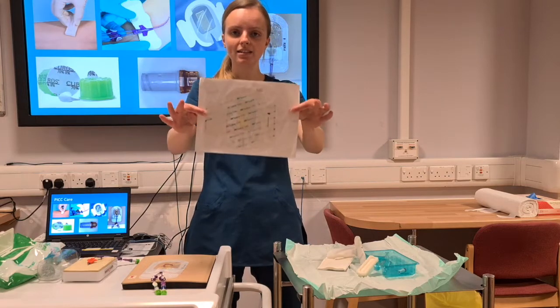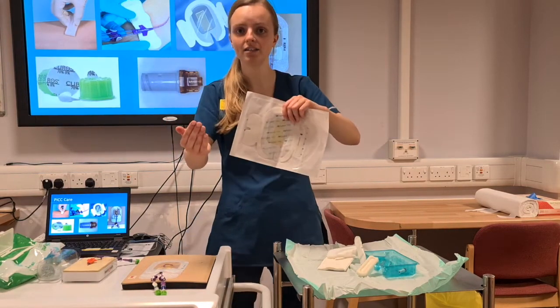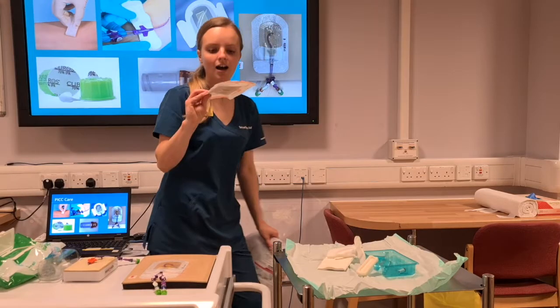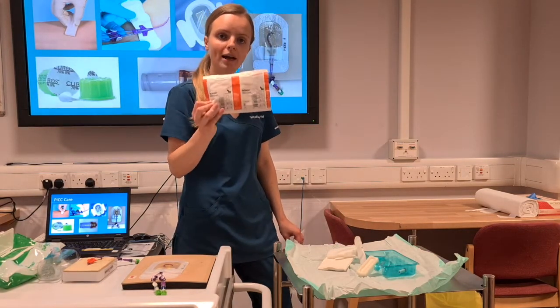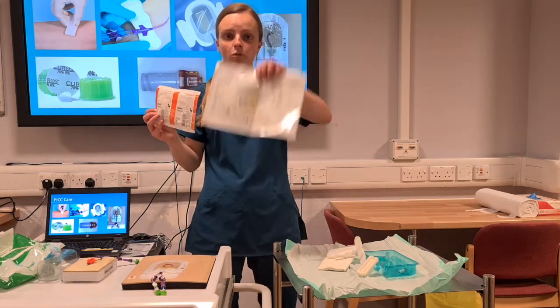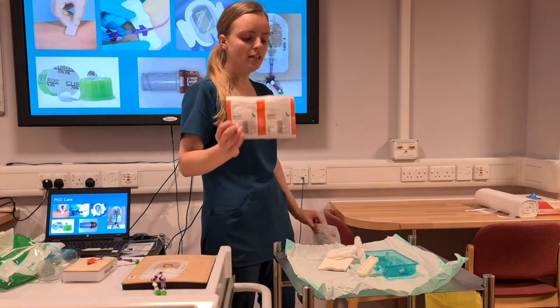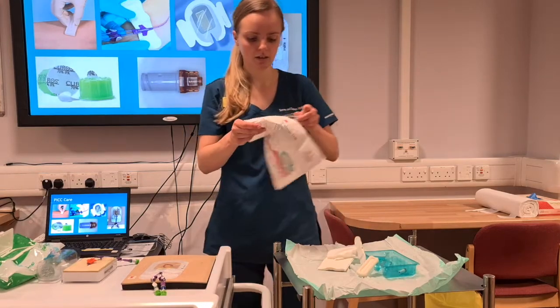So this is Tegaderm CHG. Again, you have chlorhexidine. If your patient is allergic to chlorhexidine, you need the alternative, which is, so you pop an IV 3000 on. The only trouble with this is your patient will not have an antimicrobial cover. Having the chlorhexidine over the insertion site will prevent them from getting infection, whereas this does not. So make sure your patient is definitely allergic to it.